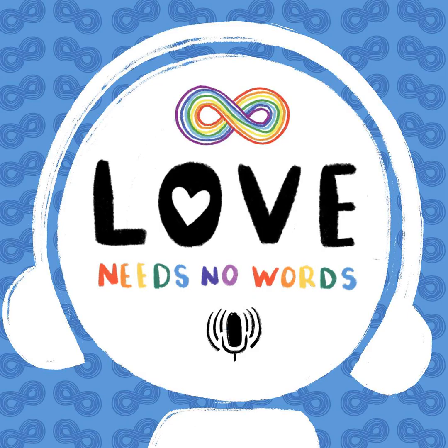Thank you for having me. I'm delighted to be here and to meet you and to speak about all things AAC and communication, which is my favourite topic. So AAC stands for Augmentative and Alternative Communication and is really an all-encompassing term for anything we use instead of speech, to help speech, to support speech, or instead of speech. So it actually covers everything from symbols, writing, switches, high-tech stuff, technology, all of that.